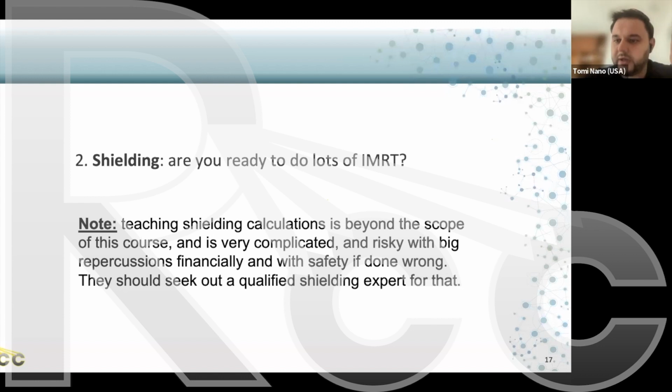So you know that you want to cover that tumor, and then you add some margin. So it is the manual determination of the field shape, whereas inverse planning refers to having an algorithm determine that field shape, that MLC pattern.